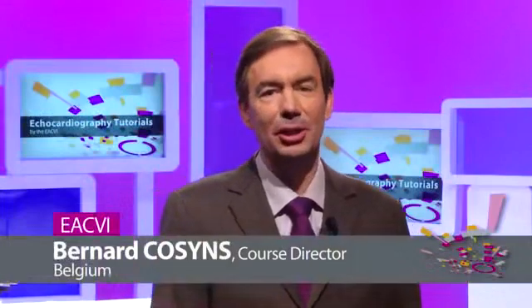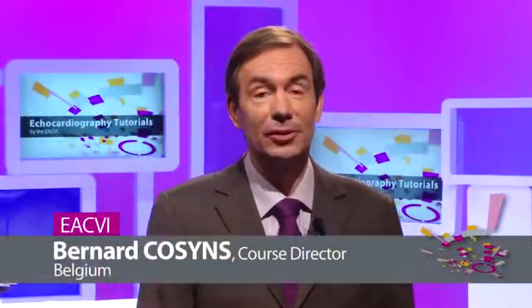Dr. Robots will now show us how to set up the echo machine. Of course, it's very important to optimize the image because the analysis and the interpretation of the echo image is highly dependent on the quality of the acquisition. Therefore, he will show us how to optimize the images via different parameters and also how to prepare the patient. The subject of this topic will be how to set up the echo machine.